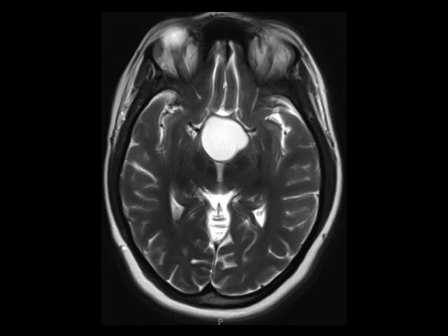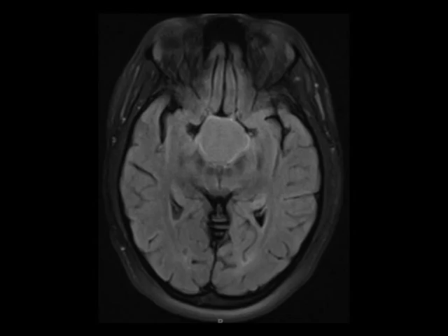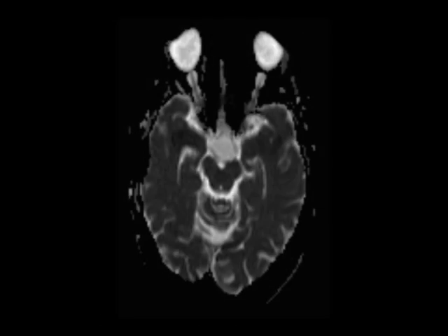There are lobular cystic components which extend into the enlarged sella turcica. The mass enlarges the suprasellar cistern with elevation and effacement of the floor of the third ventricle. The lesion extends posteriorly to the level of the interpeduncular cistern, which is slightly splayed. There is contact with and elevation of the optic chiasm and pre-chiasmatic segments of the optic nerves, as well as contact and partial encasement of the supraclinoid segments of the right and left internal carotid arteries.